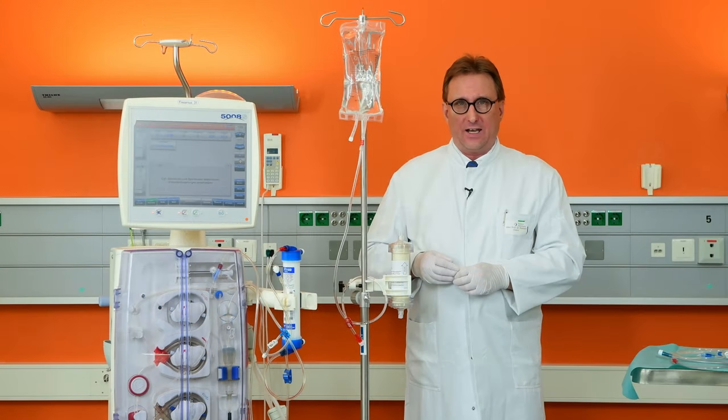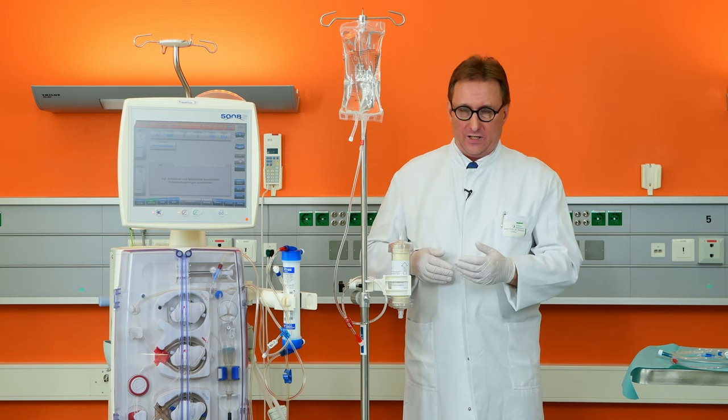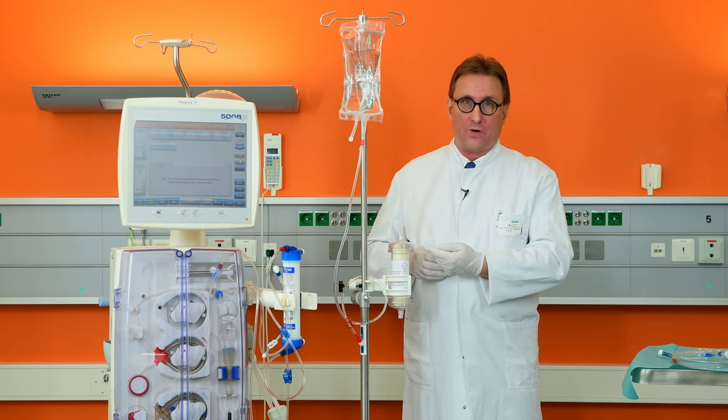Before beginning, firmly secure the Seraph in the vertical position, paying attention to the fact that the arrow is pointing up.